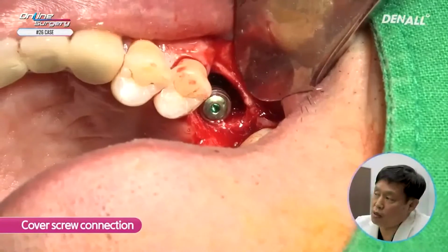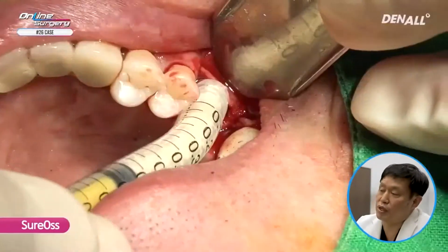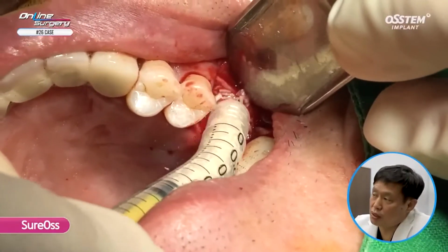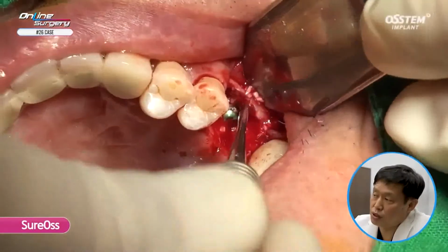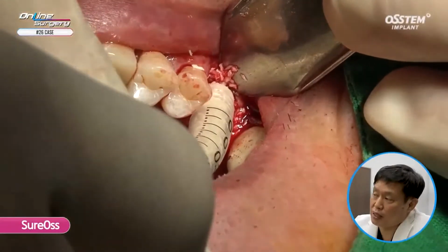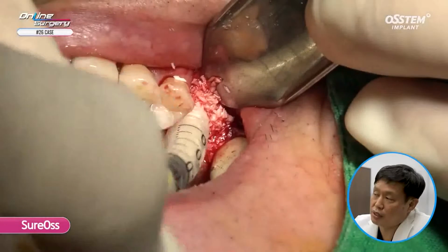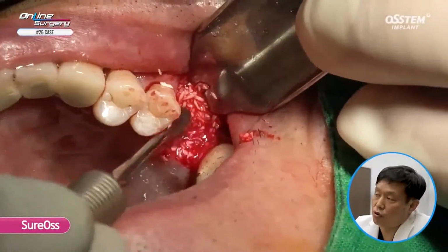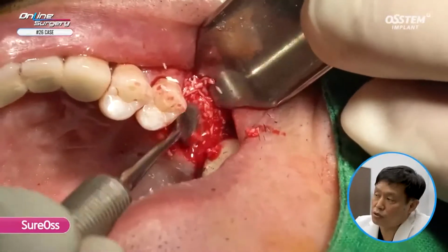As you can see, the buccal plate is intact. In the gap area, I have used an allograft called Sure Os. This is chip bone to fill the gap. Between the implant and the buccal plate, there's a gap. It's approximately 2 to 3 millimeters. Chip bone is being packed. Bone graft is done, up to the implant top.